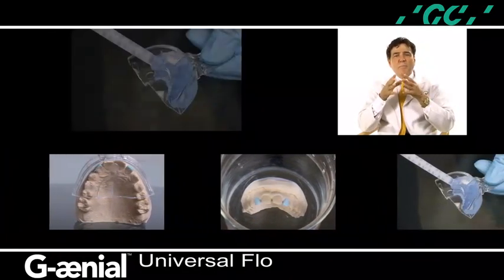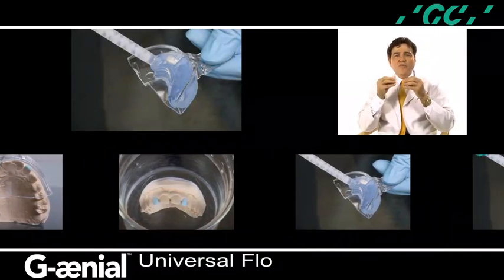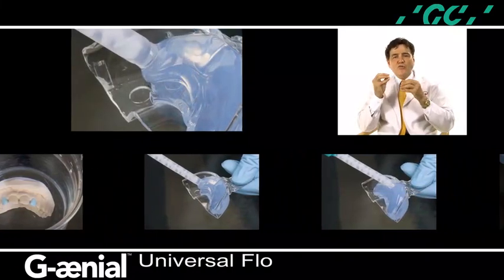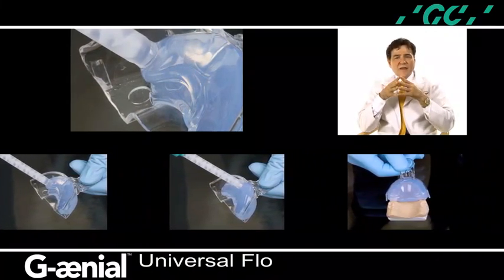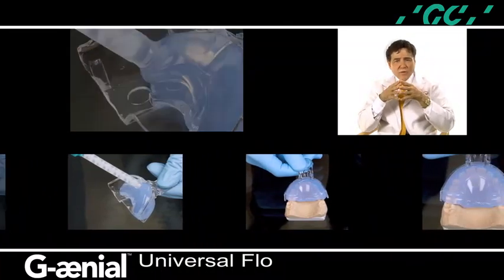A transparent polyvinyl siloxane material is injected into the maxillary impression tray. It is important to maintain the mixing tip of the syringe in the material to prevent air trapping and potential voids. Also, it's important to use non-latex gloves because the latex can change the curing behavior of the material.